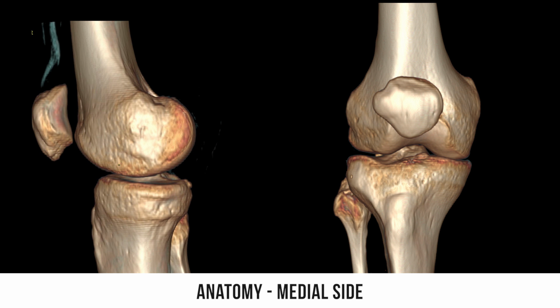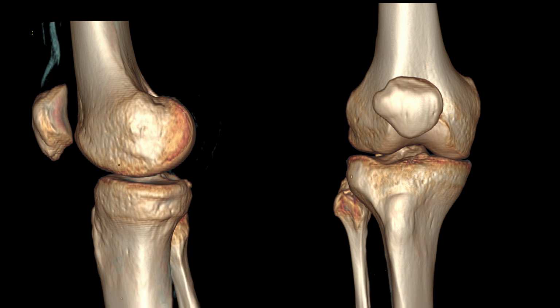We will now study the medial aspect of the knee. I suggest that we start by reviewing a few anatomical concepts. An ultrasound examination of the knee is based on simple anatomical landmarks.